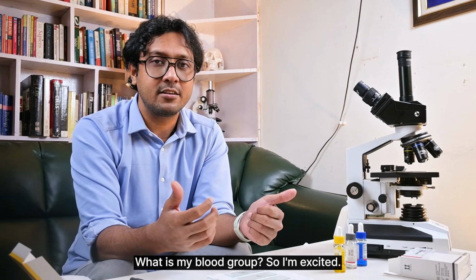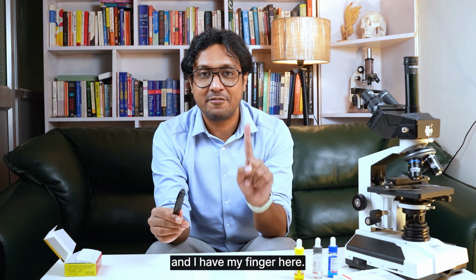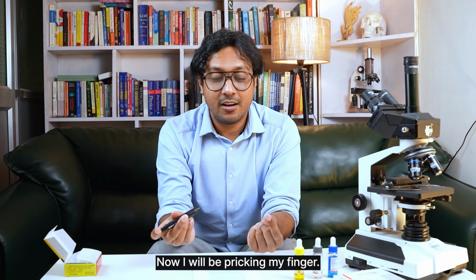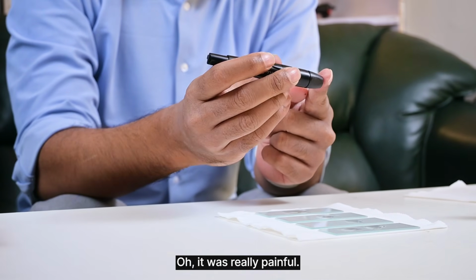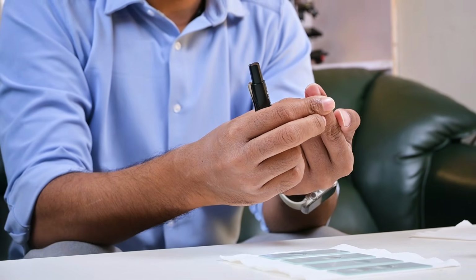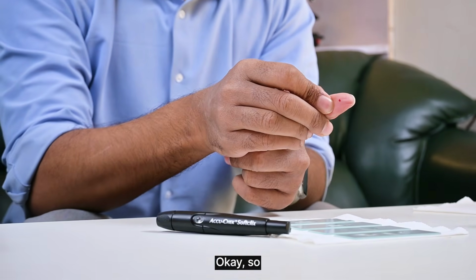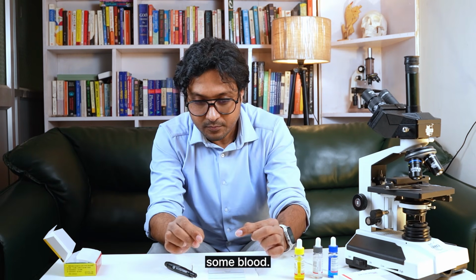So I'm excited, although I know it. Okay, so I have a pricking device and I have my finger here. Now I'll be pricking my finger. Let's see how much blood I have. It was really painful. Okay, so let's take some blood.